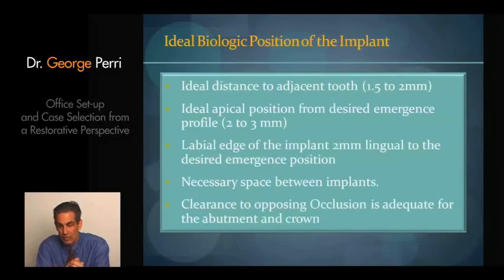In today's world, the use of cemented crowns is becoming more and more popular, but we still need to understand that we need a certain height to the abutment that will allow cementing of the restoration. We need a certain axial wall. We would like to see the cement line near or close to the gingival margin. If we're forced into cementing a crown 3 or 4 millimeters subgingival to achieve enough retention, that is not going to be a long-term biologic success with a cement line that is so far subgingival when we realize that there's no way that we can completely remove all of the cement.